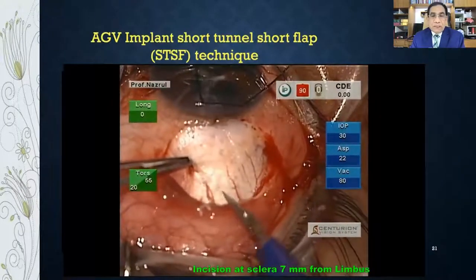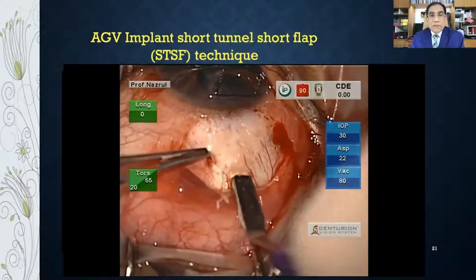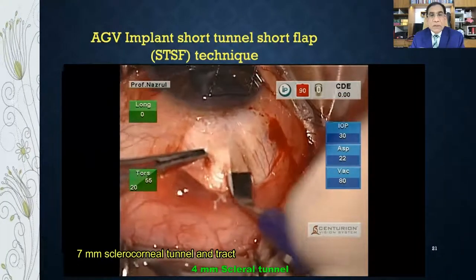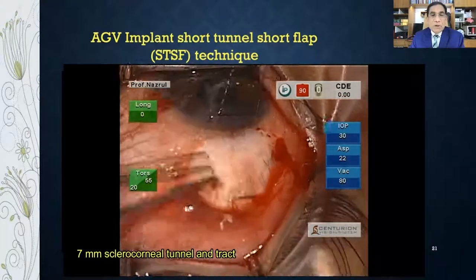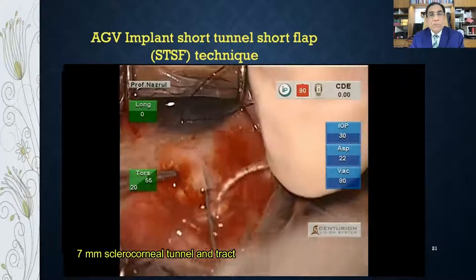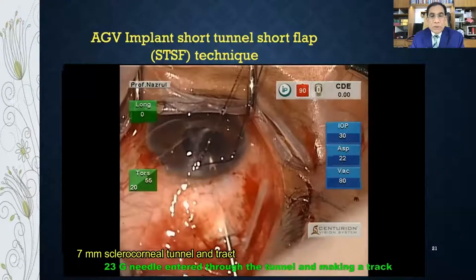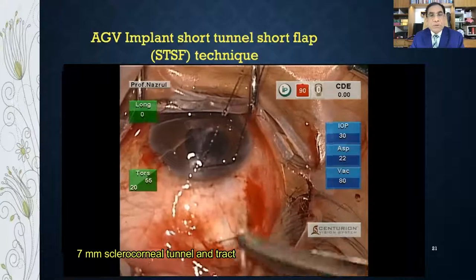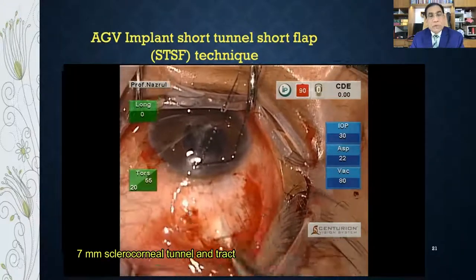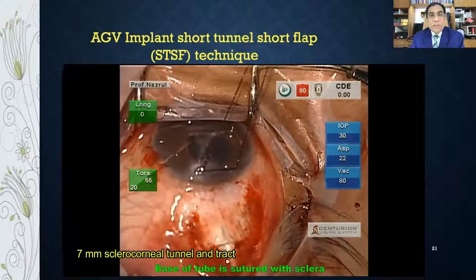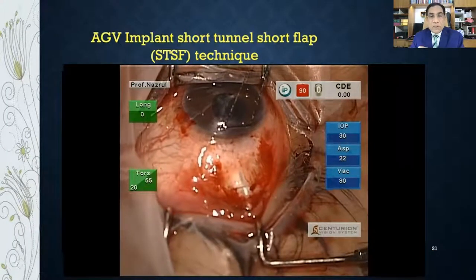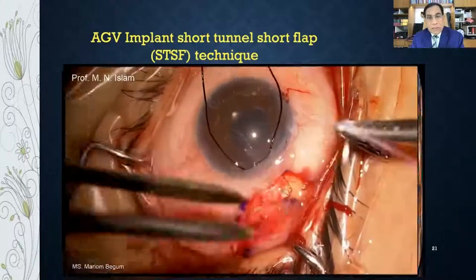Another approach is the long sclerocorneal tunnel — making a 4 mm dissection then a 7 mm sclerocorneal tunnel into the anterior chamber. This is not easy technique; I do not recommend it for beginners. Even I don't use it much myself — this is from one of my older videos. For beginners, start with the STSF technique or with a donor scleral, corneal, or pericardial graft.